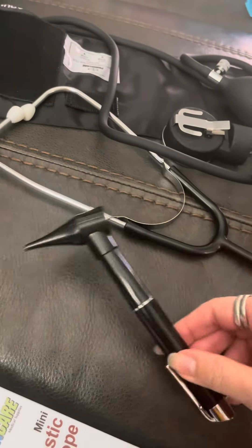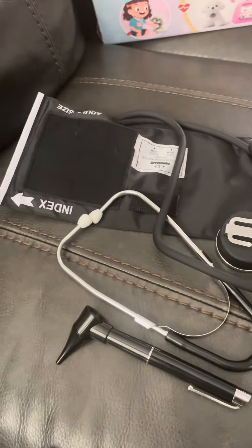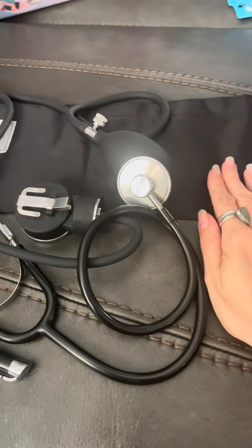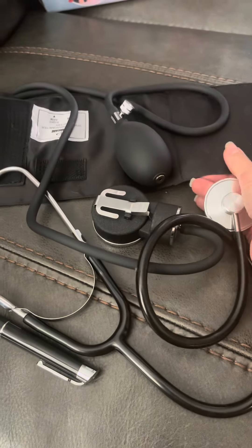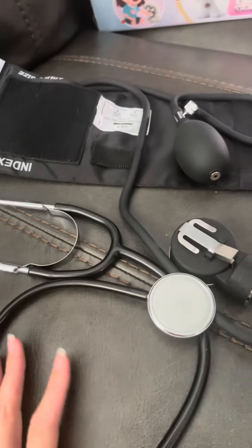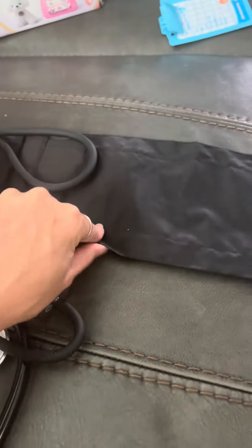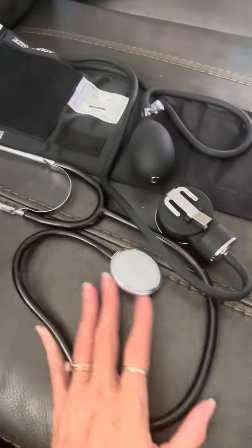For the price, this kit is great — it all works. I actually really like this blood pressure checker; this thing works super good. I'm really impressed with this set. It's easy to pack up and easy to take with you if you want to use it as a little travel bag. It's perfect.